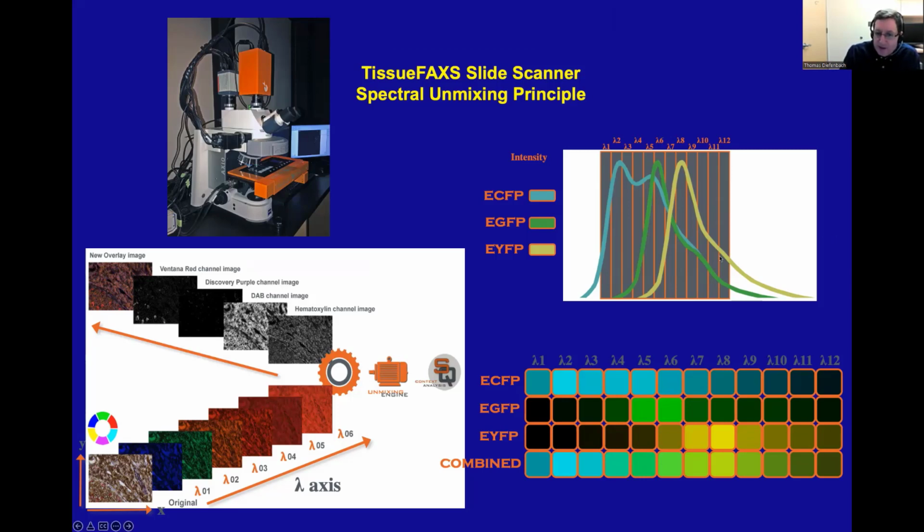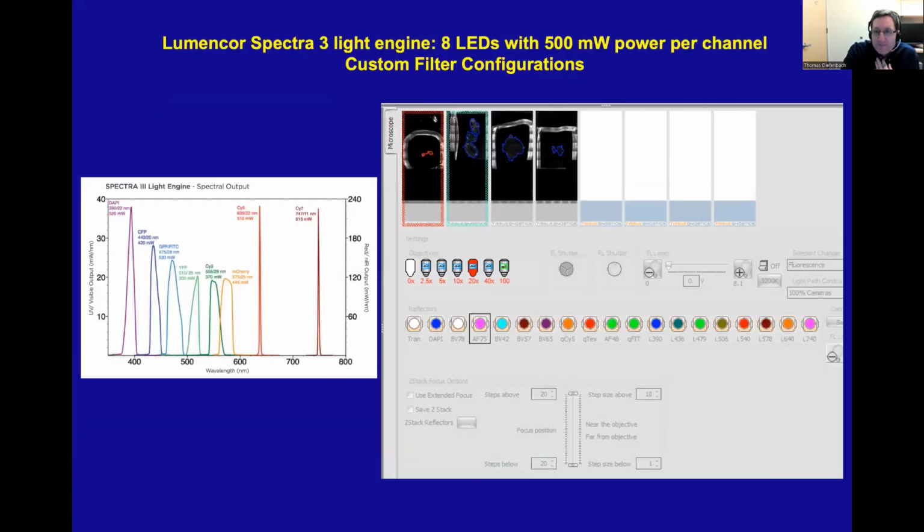The profiling is also useful if you have just a slide without staining, you can profile the background fluorescence or the autofluorescence if you have older tissue or tissue that's prone to having difficult to work with autofluorescence. You can profile that and then actually subtract it out using the software as well. Here you can see the interface that we have in the TissueFAXS software. Up on top we can see the slides. Well, 4 slides were loaded in this case out of the 8 positions.